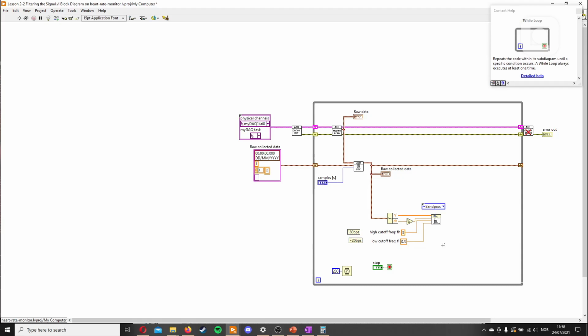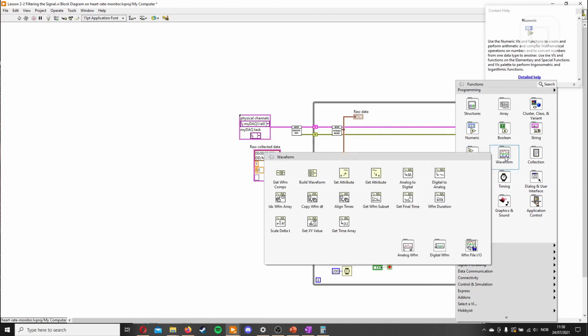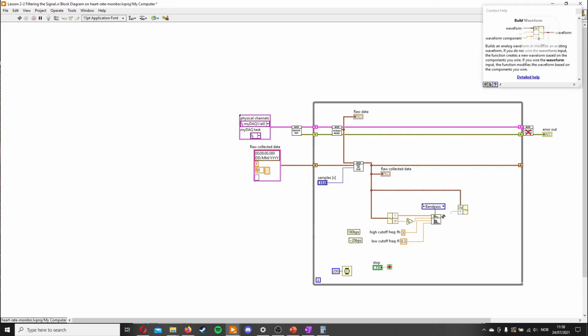We don't want it to be too close, because then it could filter out good signals, the heart rate. And we don't want it to be too wide, because then we will let in a lot more noise. We can now push this back into the signal, and we'll have our filtering. We'll go to waveform, and then build waveform. Put this here. Put this in there.